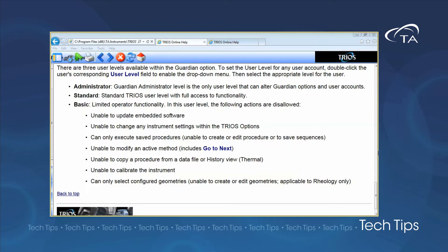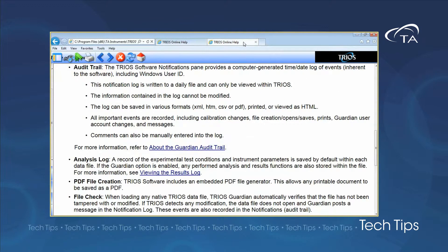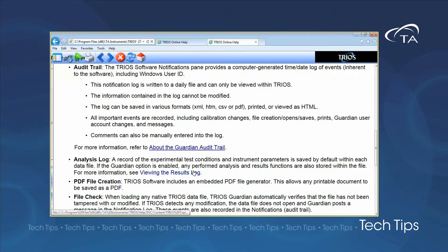The TRIOS Guardian features include the collection of an audit trail, an analysis log, PDF file creation, and file integrity check.